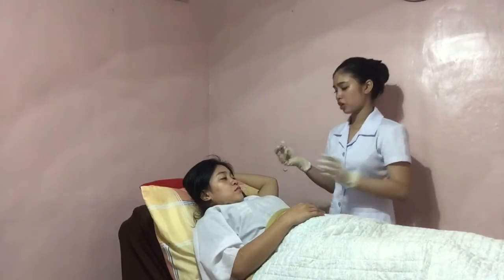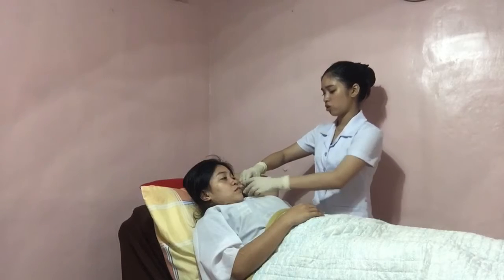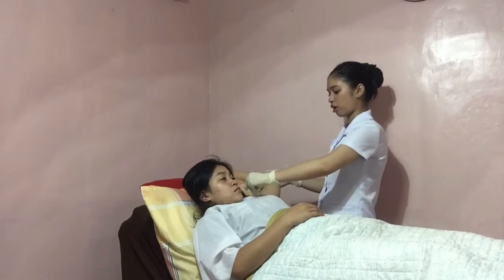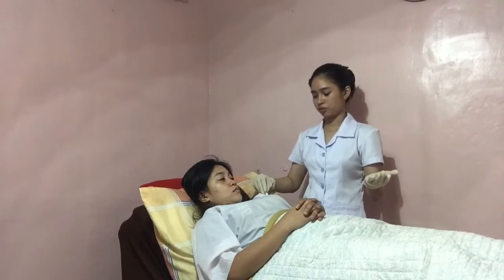So Althea, I'm gonna put this thermometer in your arm now. So can you close your arm? And of course, don't forget to turn on the thermometer. So wait for the appropriate amount of time after its placement.